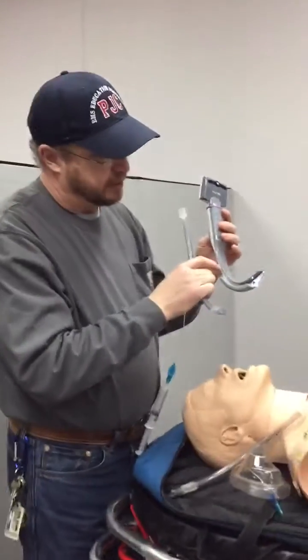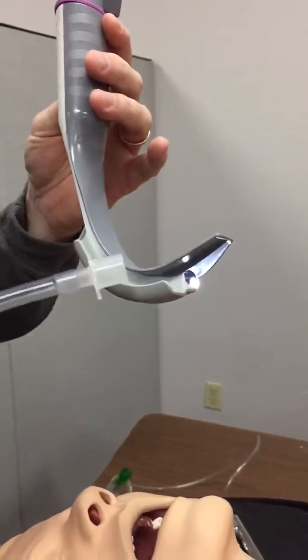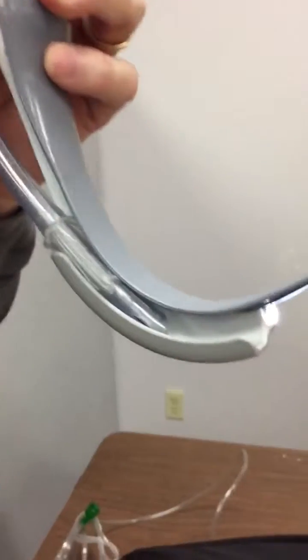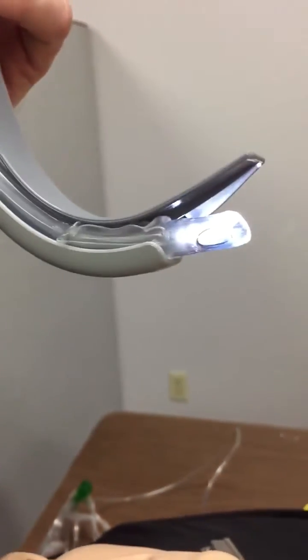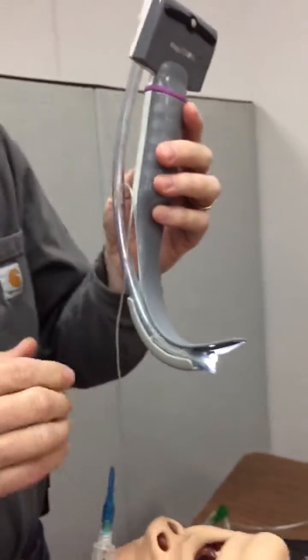This is the channel blade. This blade would be used without a stylet. It is designed to have the tube follow this channel down through here, where it will guide it right into the vocal cords.